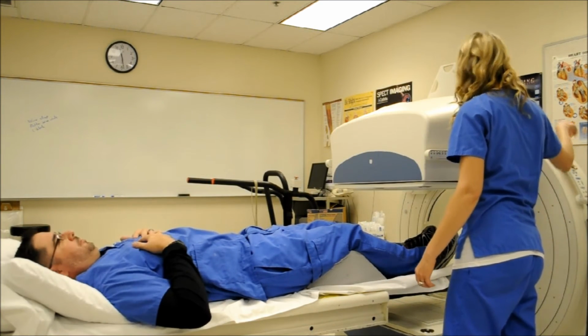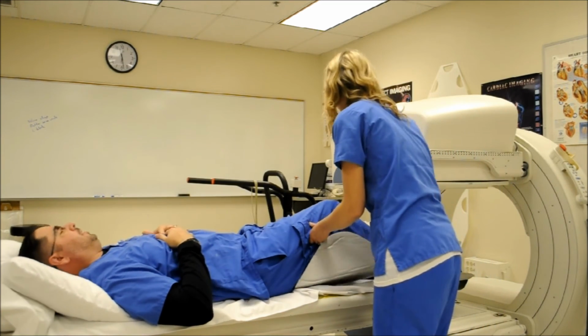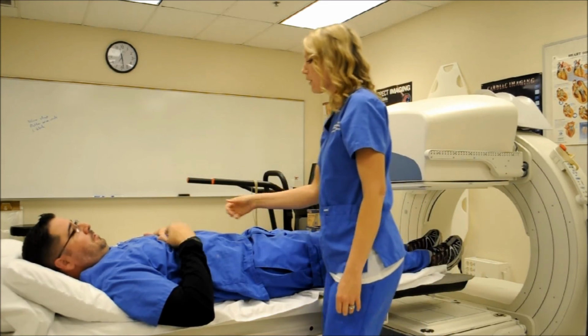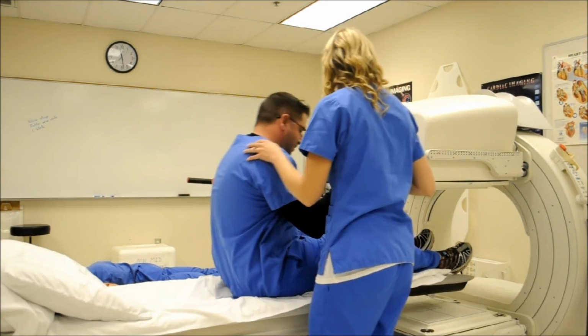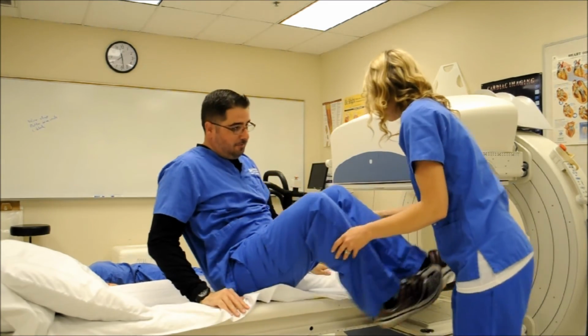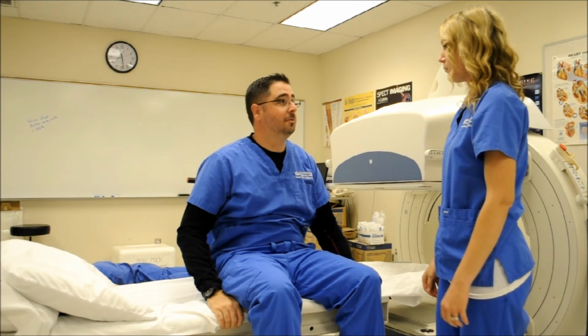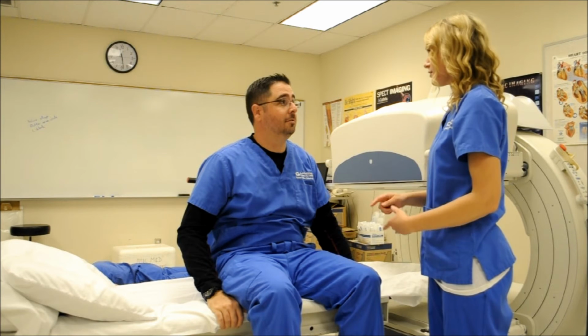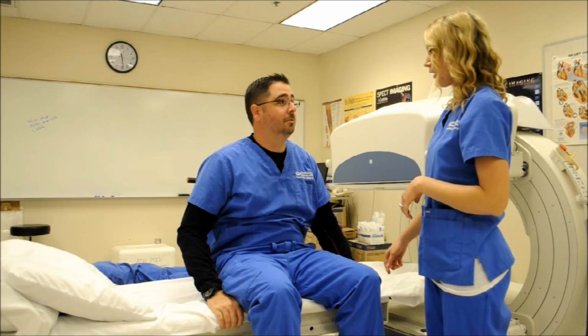All right, Rusty. You're done with the first part. I'm going to help you up. And I'll need you to be back in 3 hours from now. So at 1 o'clock, I want you to come back and we'll do the same pictures again. But this time we'll be taking a picture of the medicine attached to your bone rather than in the soft tissue and in the vein.